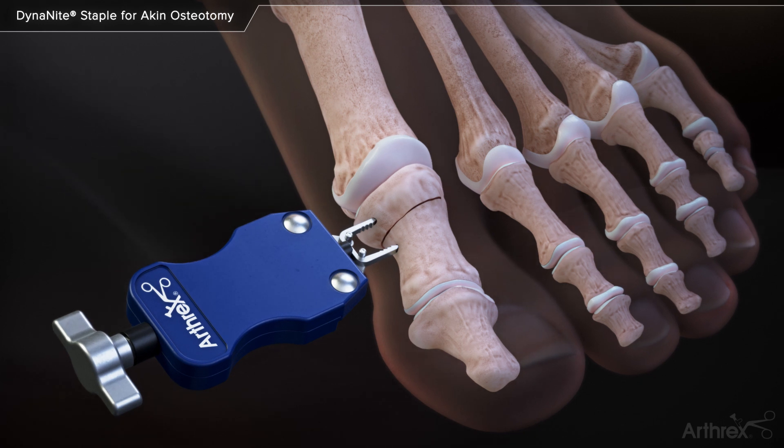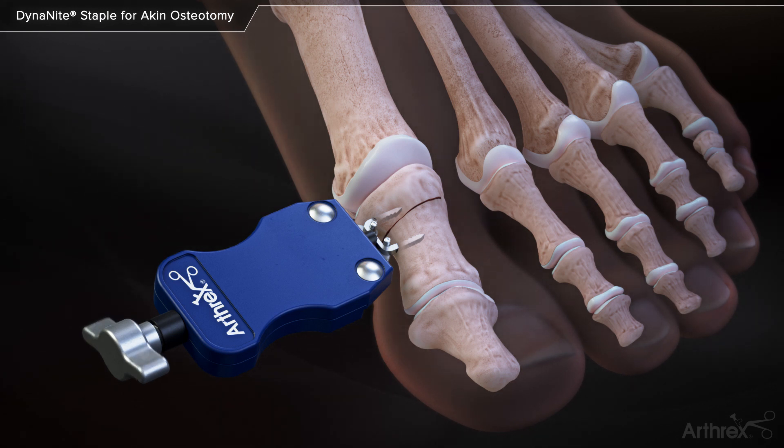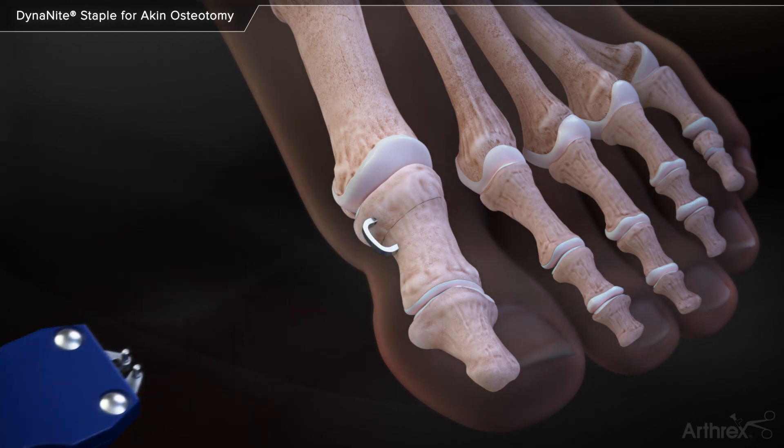Using the staple inserter, advance the staple legs into the drill holes until the device is seated against the bone. Once the staple is seated against the bone, the inserter knob is turned counterclockwise to release the tension between the staple and the inserter. The inserter is then slid away from the staple.